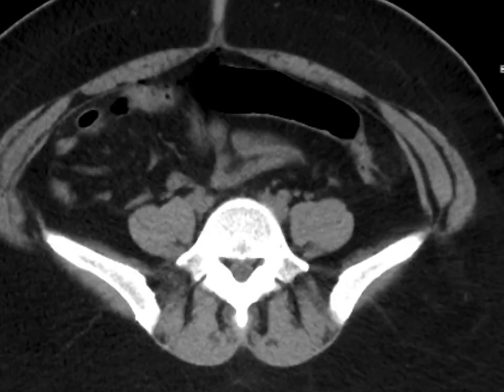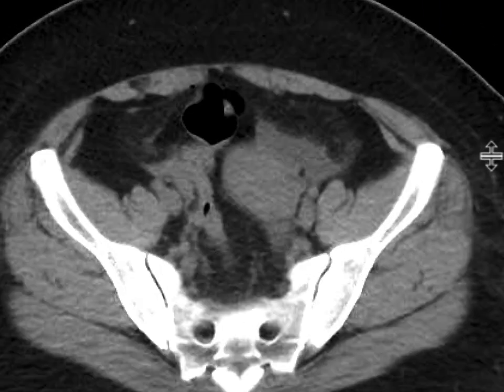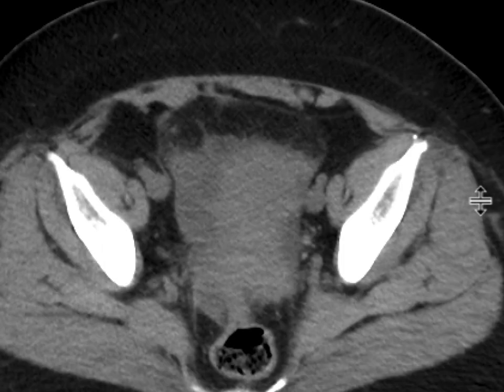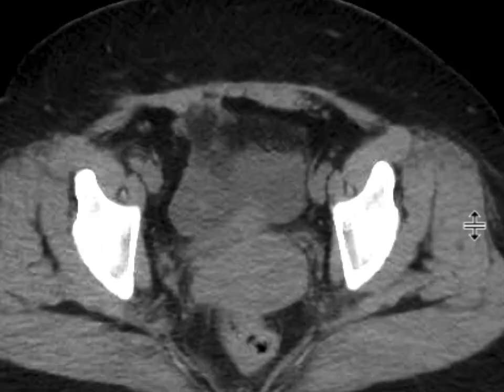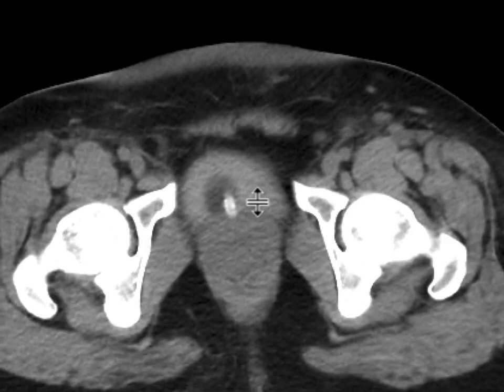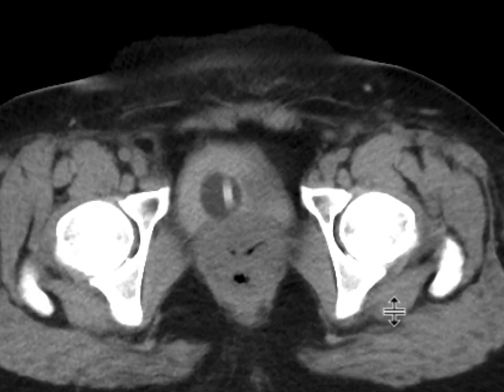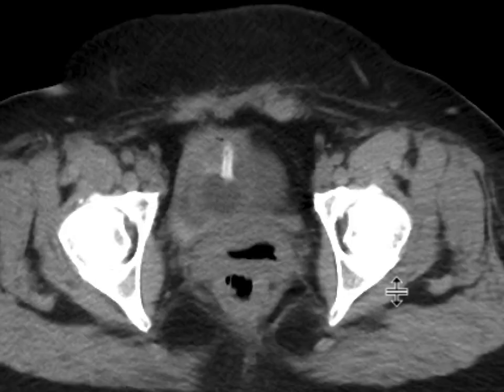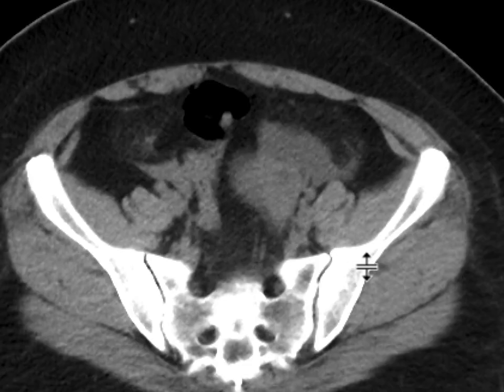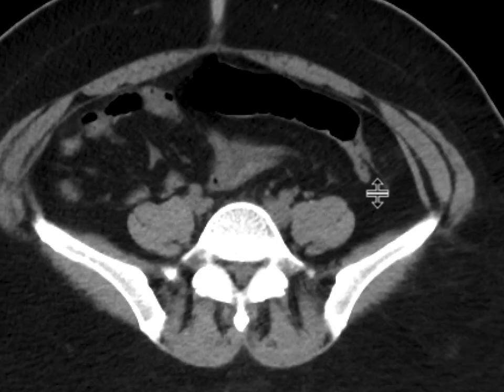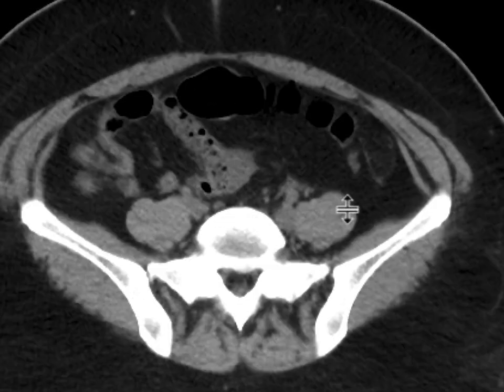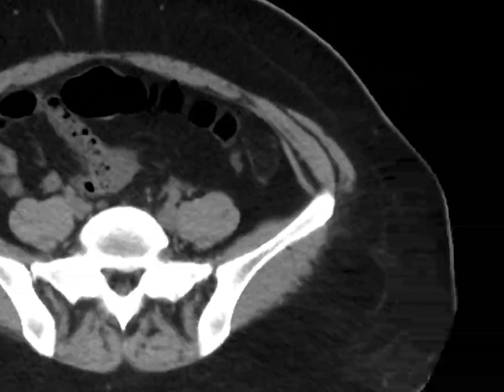Here we have the non-contrast CT of the pelvis prior to giving contrast to the Foley catheter for the cystogram. We can see the Foley catheter in place, some contrast in the prior trauma CT in the bladder right now, and there's a little bit of free fluid in the pelvis as well, and some of that can be seen within the mesentery leaves over here.